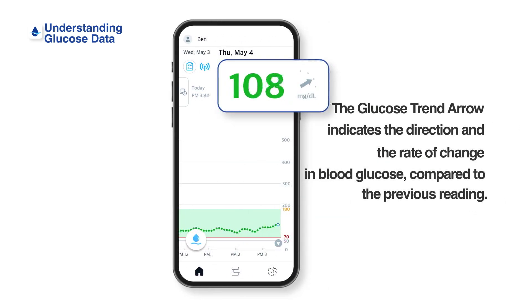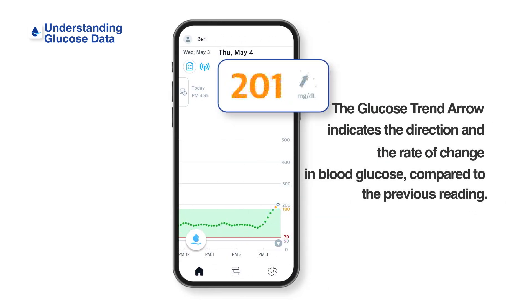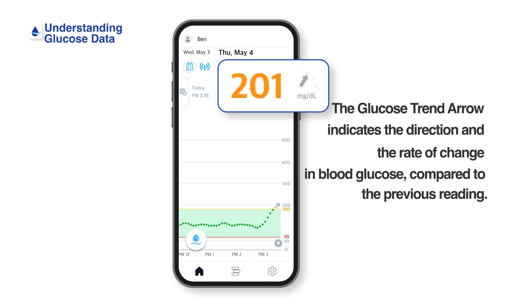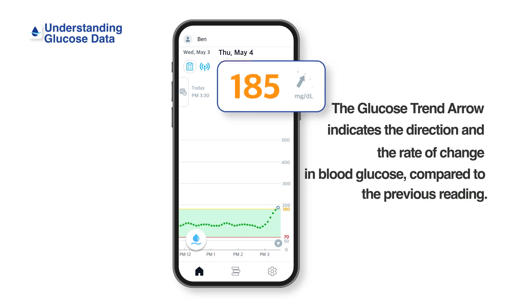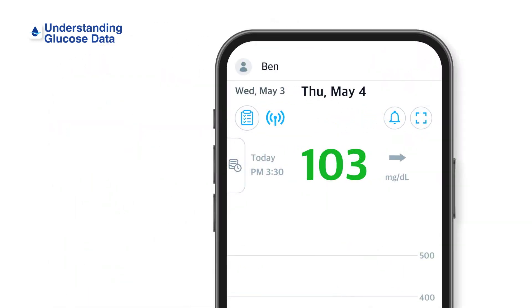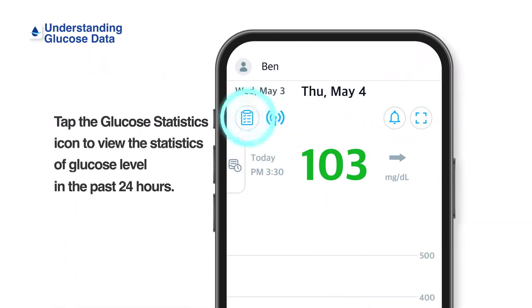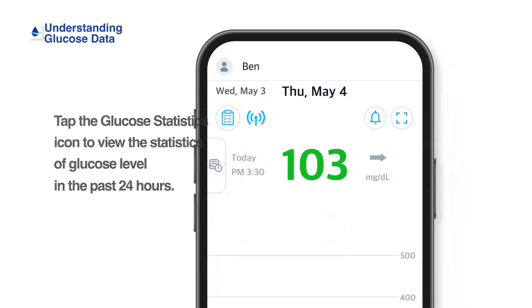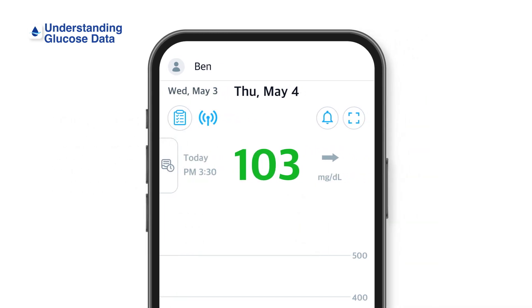The Glucose Trend Arrow indicates the direction and the rate of change in blood glucose. Compared to the previous reading, it is displayed as an arrow on the right side of the latest glucose reading on the home screen. Tap the glucose statistics icon at the top left corner of the home screen to view the statistics of glucose level in the past 24 hours.